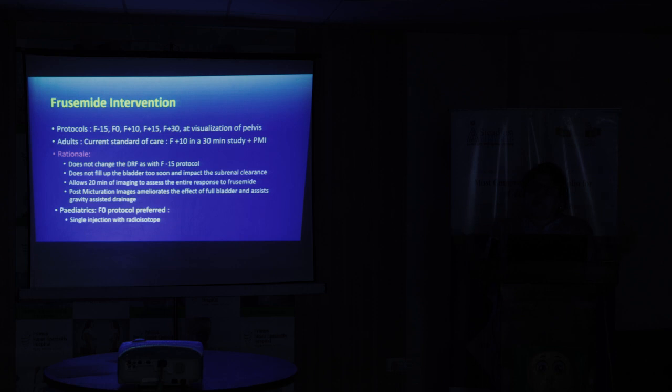So if you see that a pelvis has filled up and then you give Lasix and the pelvis clears out, you know that this patient is responding to the Lasix. But if you've given Lasix prior to starting the study, then it sometimes becomes difficult to assess whether this is the effect of Lasix or whether it is spontaneously draining. All right. Now, in pediatrics, sometimes the F0 protocol is preferred simply because you can give the Lasix and the radioisotope in the same injection. If you give an injection in the middle of the study, the child may move and your renal curves may get spoiled.